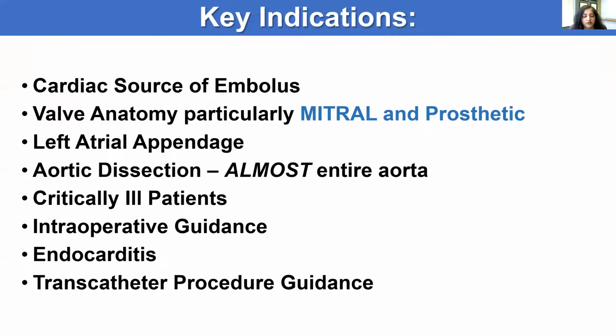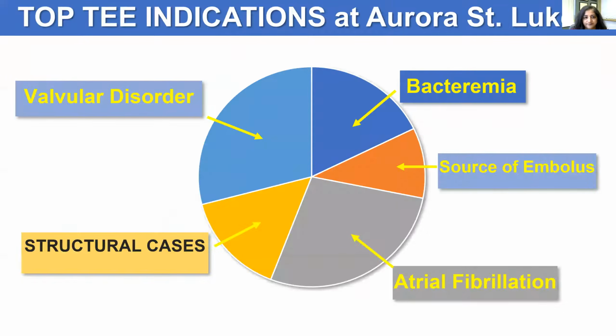You'll learn more about intraoperative guidance in other lectures. You'll learn more about TEE and its use in endocarditis in other lectures. And you'll learn more about transcatheter procedure guidance in the primer of interventional echo.